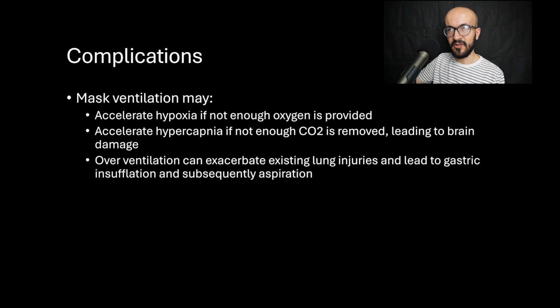Finally, let's talk about the complications. So mask ventilation may accelerate hypoxia if not enough oxygen is delivered, and it may accelerate hypercapnia if not enough carbon dioxide is removed, leading to brain damage. And mask ventilation may also lead to overventilation, which can exacerbate existing lung injuries and lead to gastric insufflation and subsequently aspiration. And with that, we reach the end of this video.